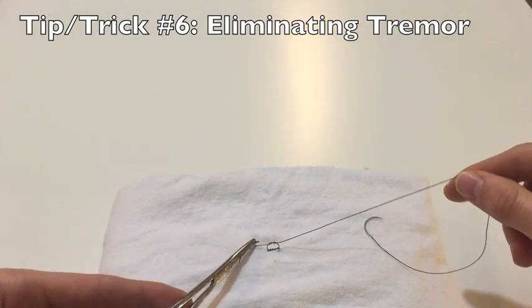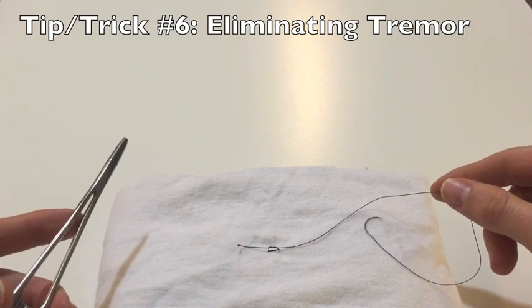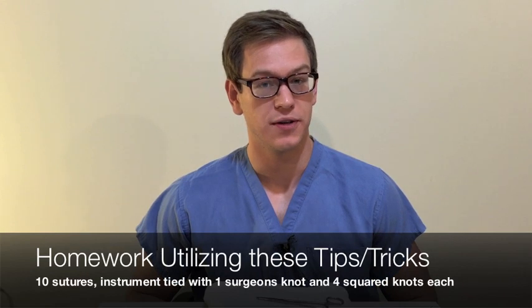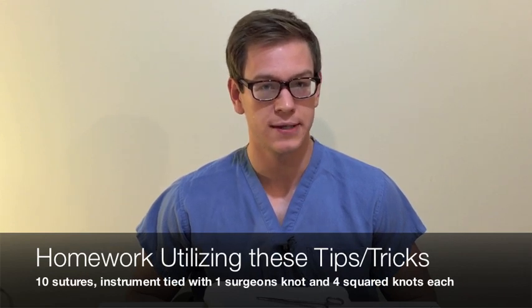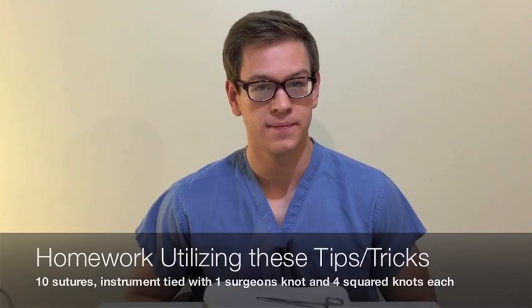Coming through and laying down that beautiful square knot — and that's my last technical trick, trick six. So that concludes all of my tips and tricks for this video. More important than watching this video is to practice it yourself. I recommend that you try to throw at least 10 simple interrupted sutures using all six of the knot tying techniques we talked about here — throwing one surgeon's knot followed by four squared knots for each. Thanks so much.